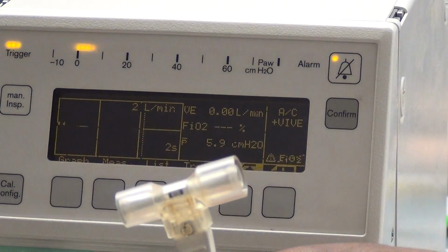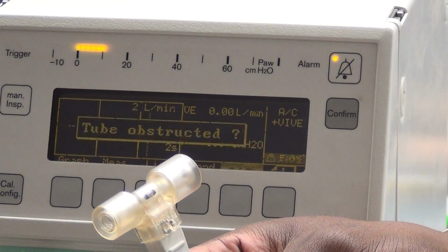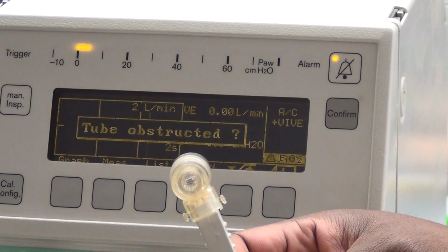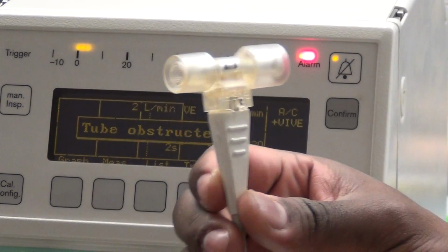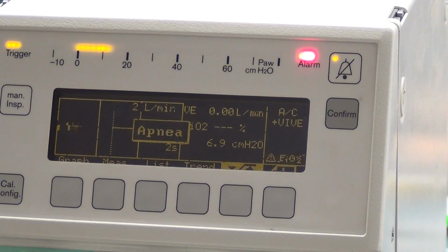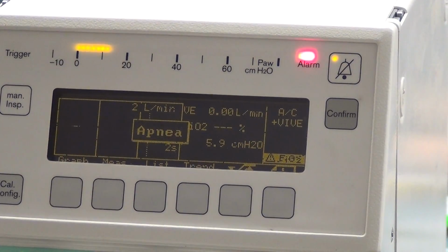Now, the thing to notice when you calibrate the flow sensor is that the message pops up that the tube is either obstructed, or you may see an apnea alarm or message on the screen. That's because this sensor recognizes that there's no flow coming through the sensor. So we'll put this off to the side for now, and we'll focus on setting the actual ventilator.